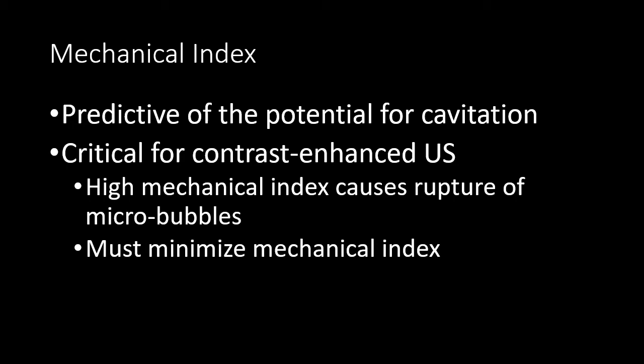In medical diagnostic imaging, understanding the mechanical index is critical for performing contrast-enhanced ultrasound. And that is because a high mechanical index can rupture the microbubbles that we are injecting into the bloodstream. When you are doing contrast enhanced imaging, you have to minimize that mechanical index so that the microbubbles have time to circulate through and give you the characteristic enhancement patterns of the lesions you are trying to detect.